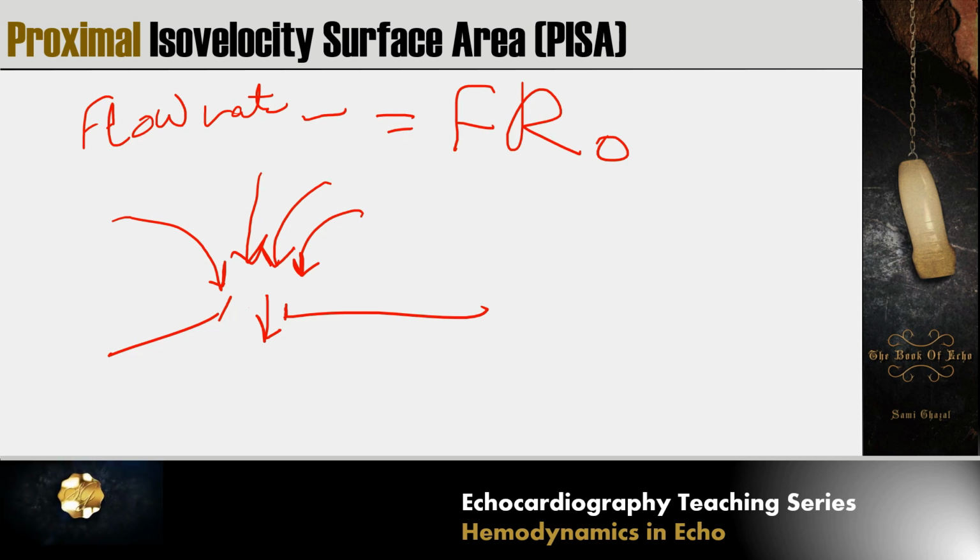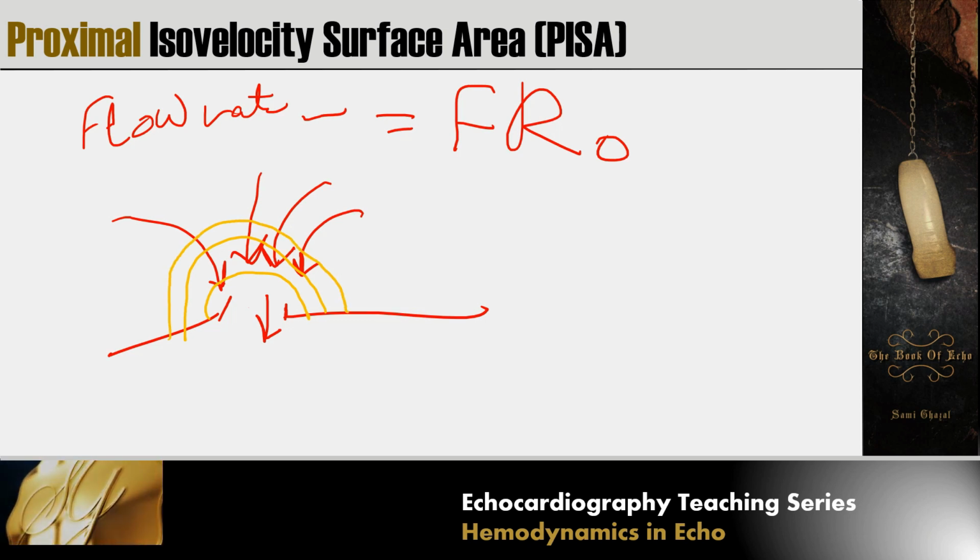Not only that, it will form a hemisphere like this. This is fluid dynamics. So when the flow reaches an opening, it will accelerate and form a hemisphere.